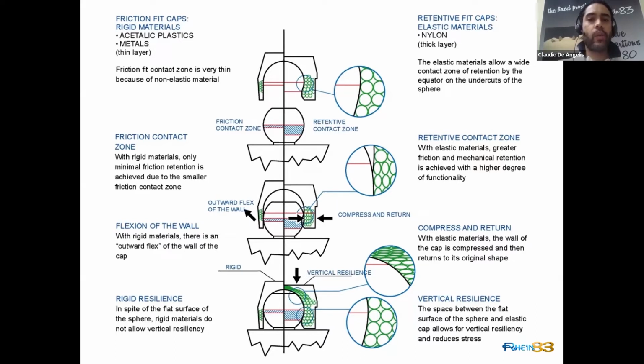So what we can achieve with those plastics is a retention of the removable denture, which otherwise, as a simple complete denture, is able to move, to navigate over the gingiva, as I always say, like a boat over the gingiva. And with this device, with an attachment, we provide retention to the denture.